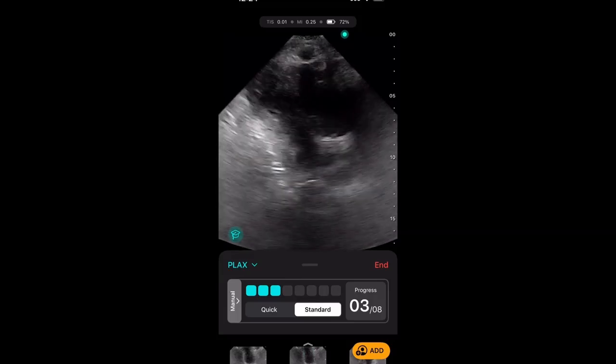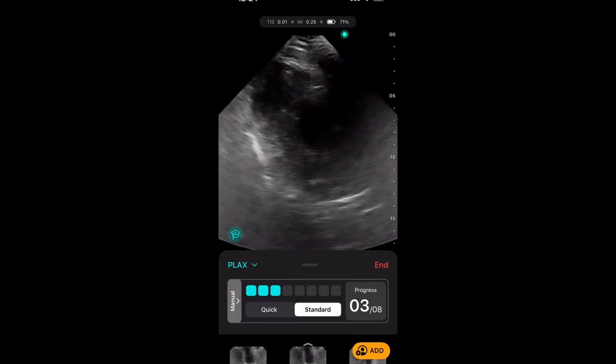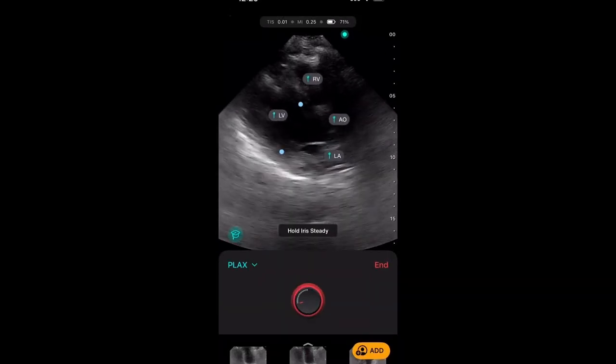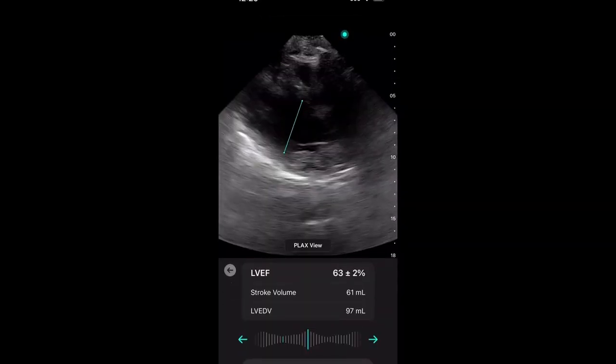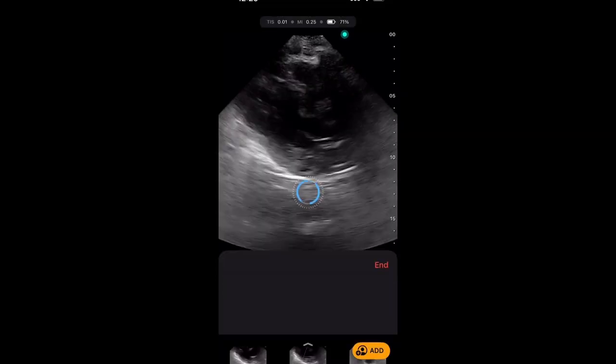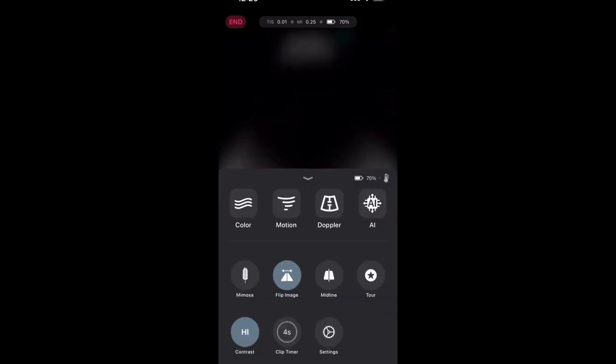Here I'm holding it steady in the parasternal long axis and it gave me an EF, though it wasn't really a great image — I don't have a great parasternal long axis view here. But the system can work in either auto or manual mode. Let's go back and look at some other features: Doppler, color, and imaging quality.